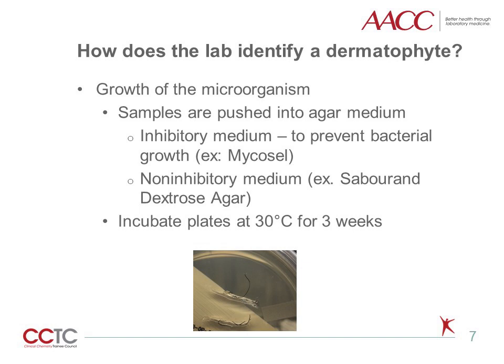Culture is the better approach if a more definitive diagnosis is required, or if susceptibility testing is desired in cases of treatment failure. The specimen is inoculated into medium and allowed to grow for several weeks. The types of media can vary between labs, but typically more than one medium is used. This is because the specimens required, again hair, skin, and nails, are colonized by commensal organisms, or our normal bacterial flora. And so an inhibitory media containing antibacterials such as chloramphenicol and cycloheximide is used to prevent these organisms from overgrowing the mold. Remember that bacterial growth can be much faster, taking a day to become visible on a plate, and molds can take up to 3 to 4 weeks.